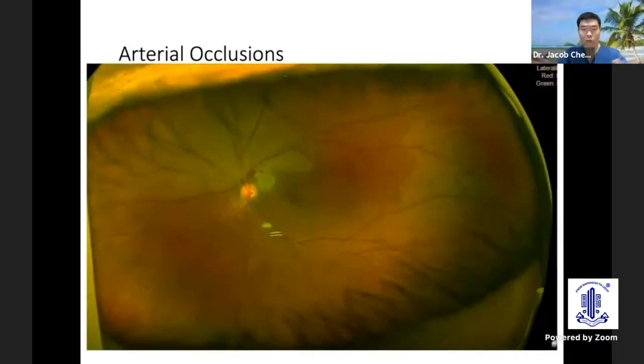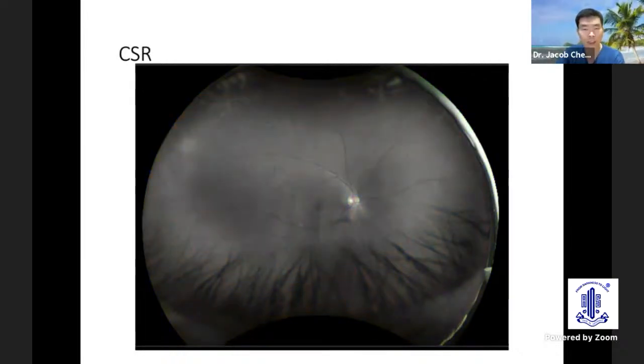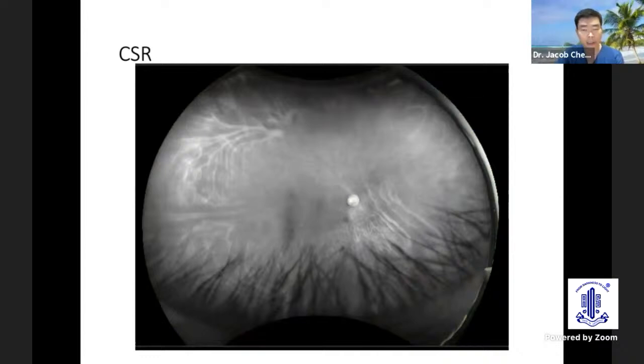Again, with the ultra-wide field, you can see the pale, edematous, swollen retina on this color fundus photograph. Another routine or beyond-routine case will be a CSR evidenced by the pigmented tracks temporal to the fovea. Not much on the green channel, but here on the choroidal or red channel, you can see the dilated vessels.